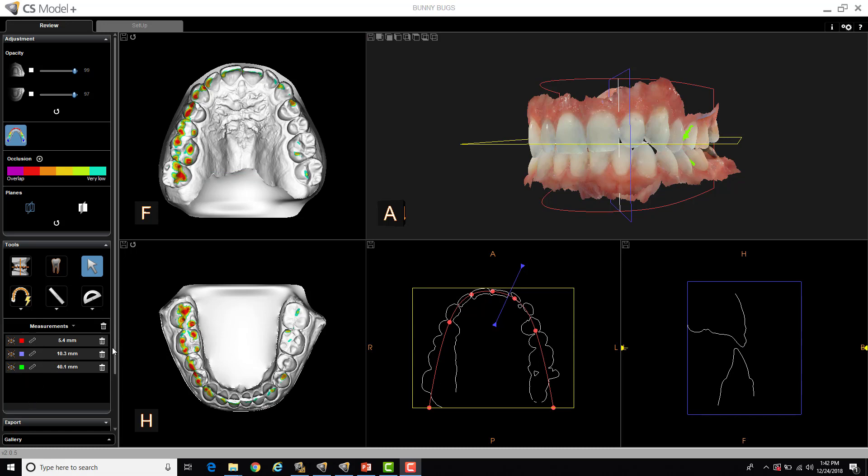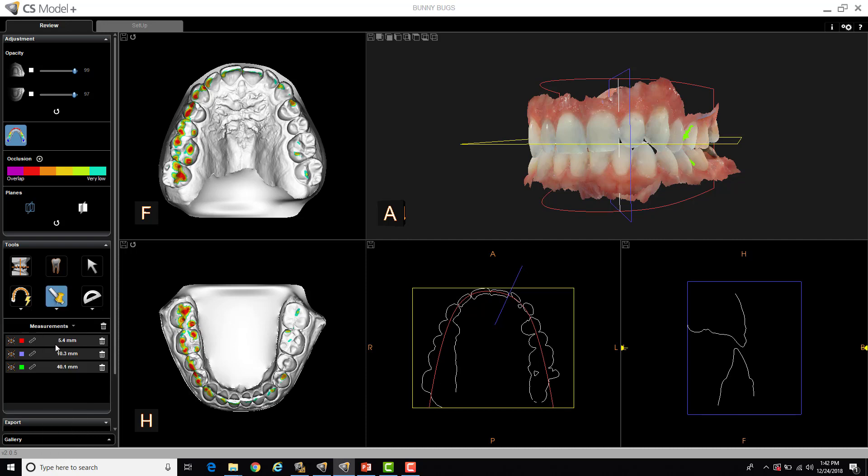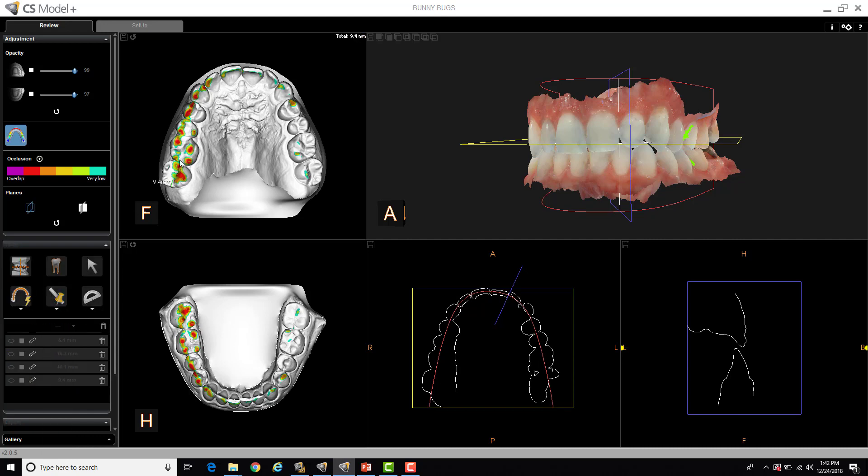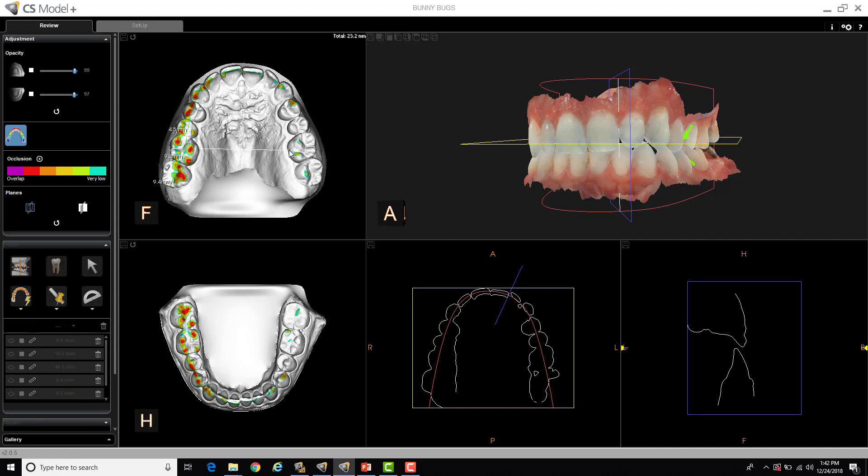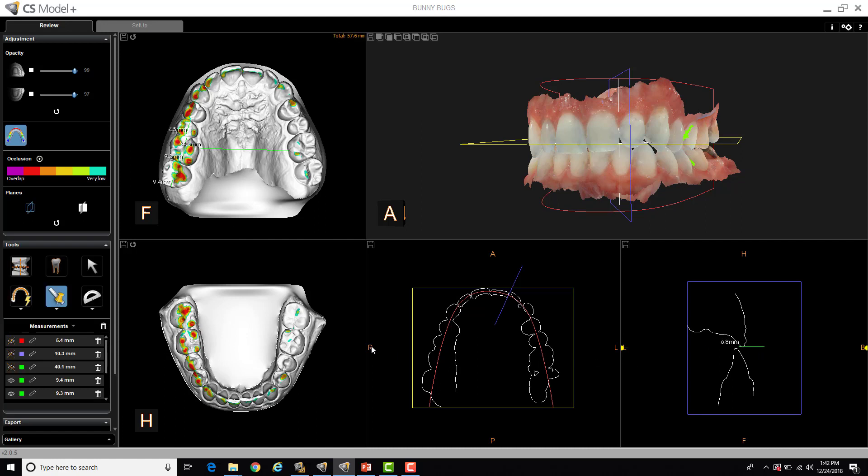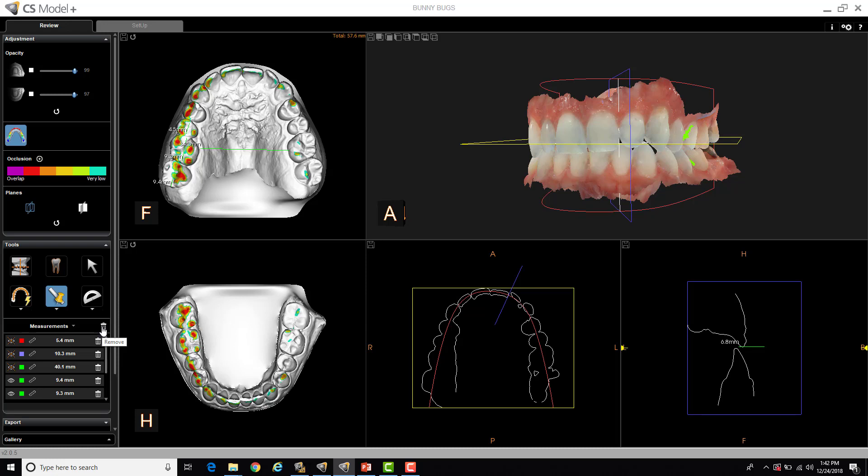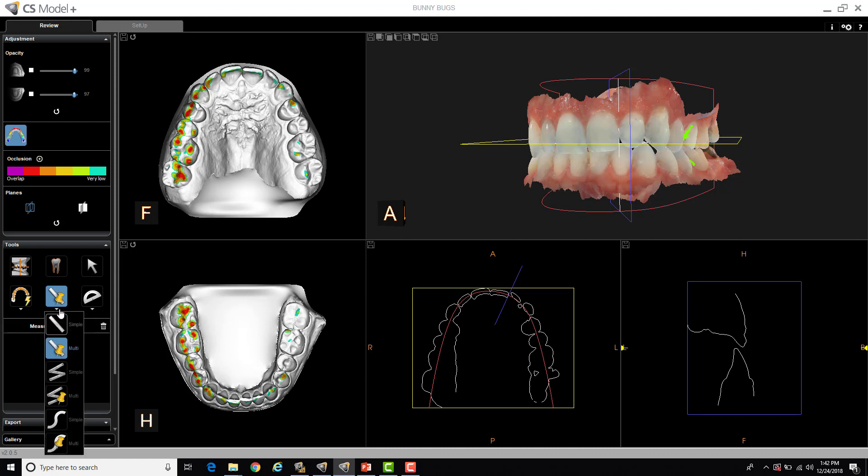If I want to take multiple measurements without having to go back and forth to my ruler, I can select my little drop-down arrow and select multi. And now I can actually select multiple measurements all in a row very easily, without having to go back and forth to my ruler tab. And I can delete all these as well, just with that single garbage can on the top. To change it back to a regular measurement, of course, you would change it back to either the regular ruler or just go back to my selection tab, which I can then now grab any of my bars and continue to use the software like normal.